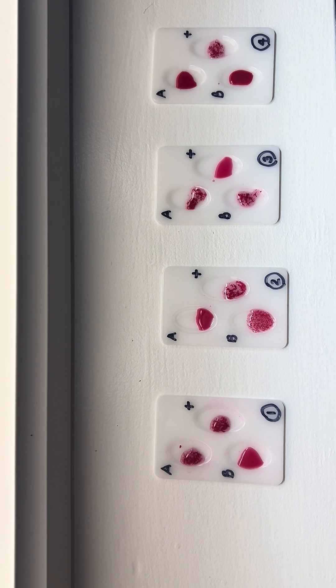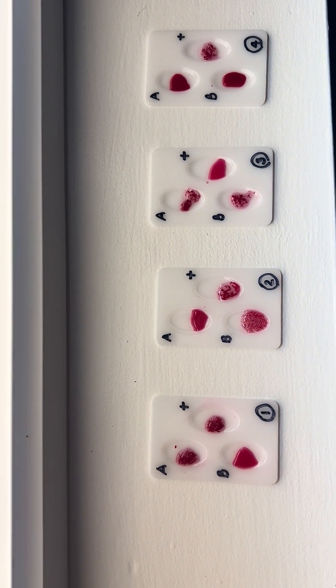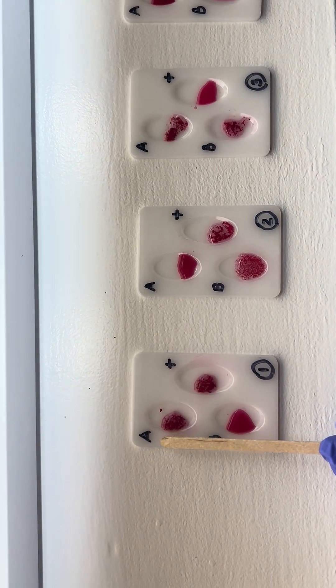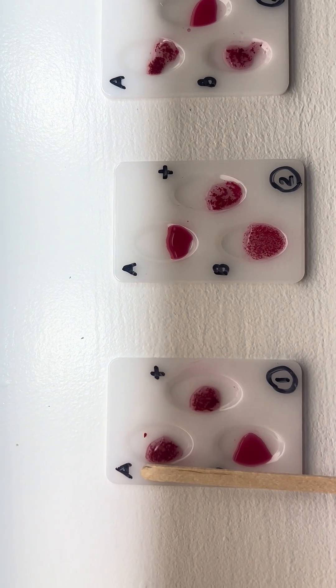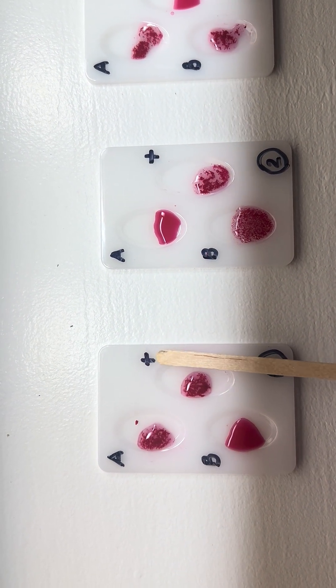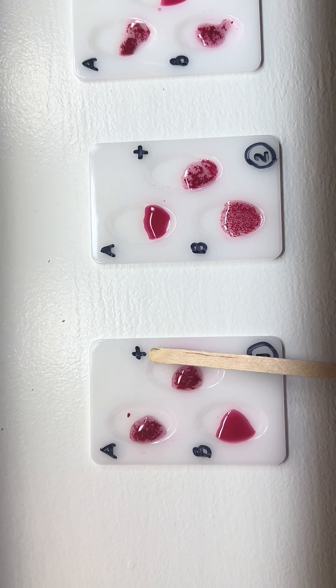We let the plate sit for two minutes and now we're ready to read the results. In tray number one, which is for patient number one, you see agglutination in the A well and the positive well — therefore this patient is A positive.